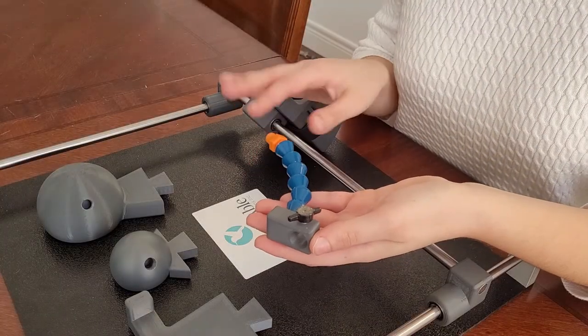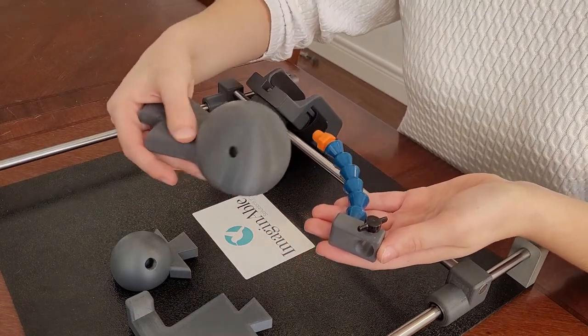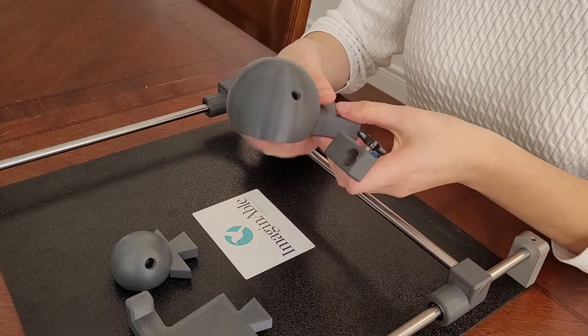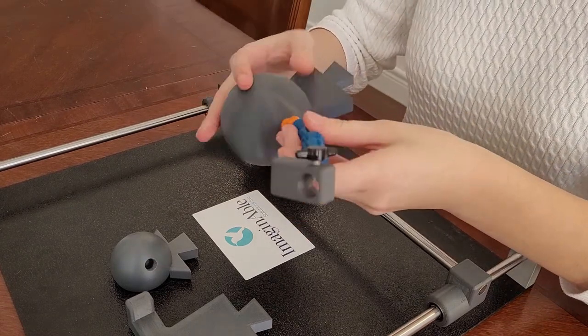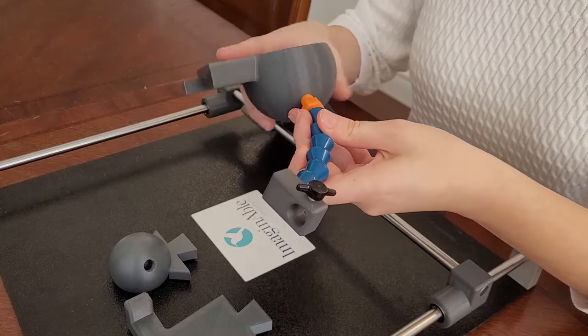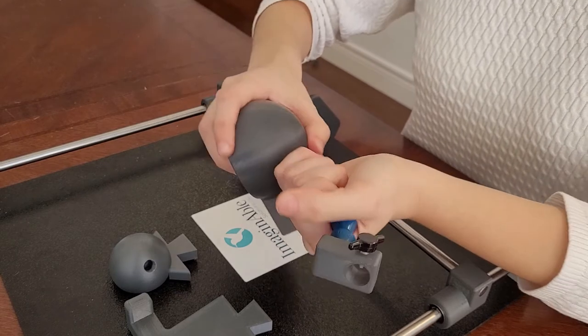This is our utensil arm. Our ambidextrous handpiece allows the utensil arm to be installed in either the left or right side depending on your dominant hand. Since I am right-handed, I will twist the end of the utensil arm seen in orange in the left hole of the handpiece until it is secure in place. If you are left-handed, twist the arm into the right hole.